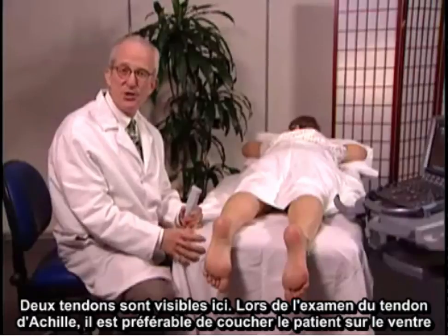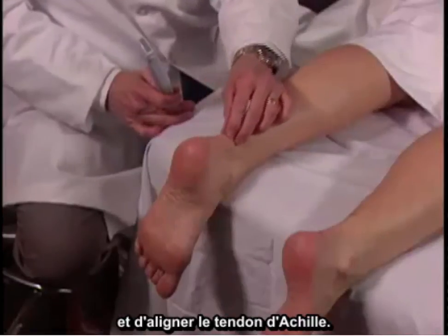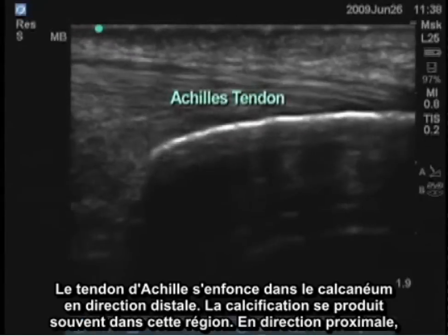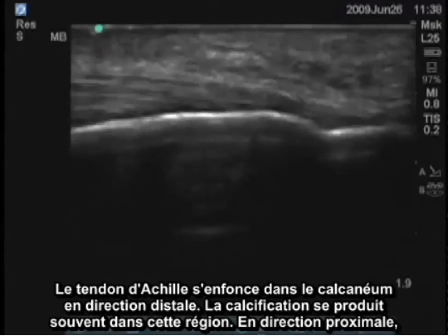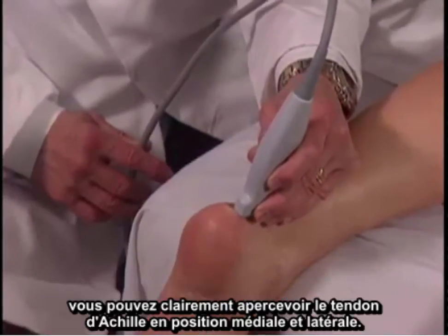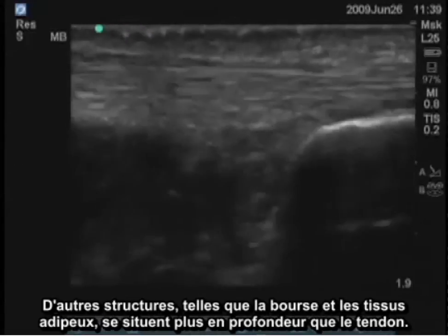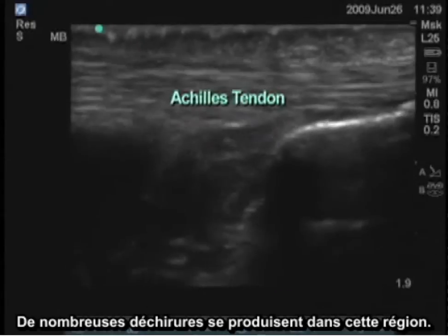For examination of the Achilles tendon, it's best to have the patient in the prone position and have the Achilles tendon lined up. The bony structure on the screen is the calcaneus, and the Achilles tendon is inserting into the calcaneus distally — this is a frequent zone of calcification. Going proximally, you can get a very nice view both medially and laterally of the Achilles tendon. The structures deeper to the tendon include a bursa and some fatty tissue. This is the area where many tendon tears occur.